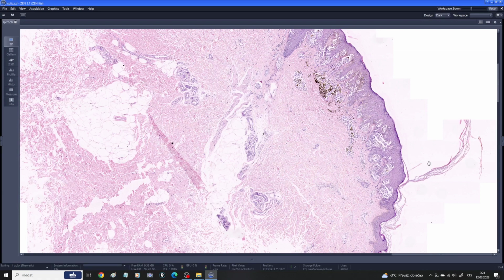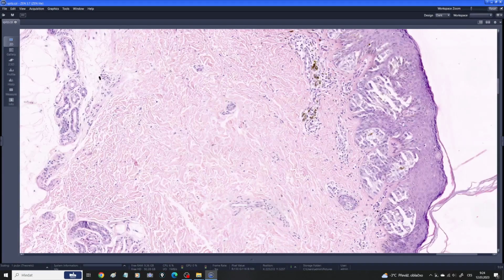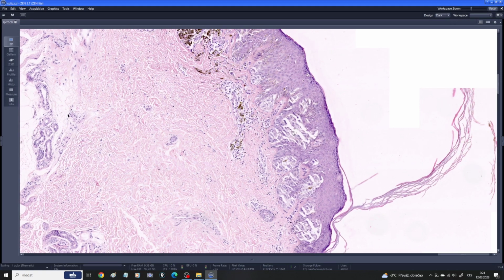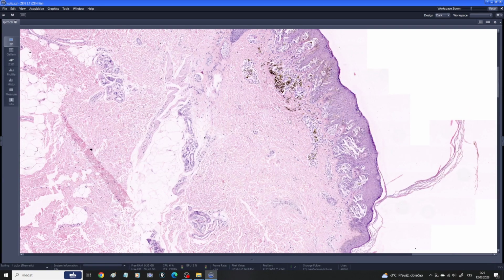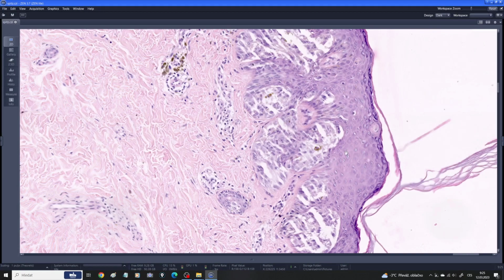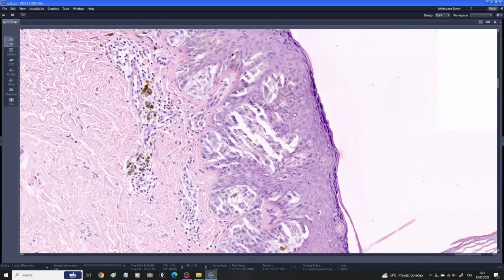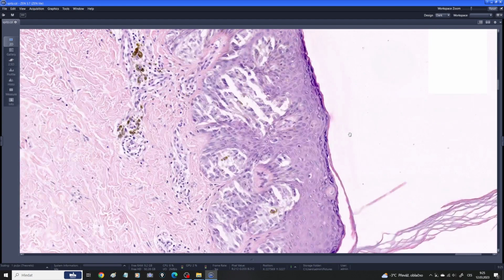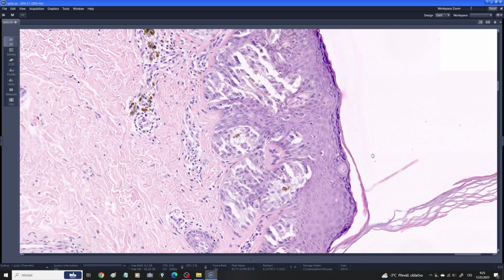And how does it look like histologically? Well, first of all, sorry for the quality of the slide. The slide is a little bit shattered, but I think we will be able to appreciate the basic features. And here you can see the lesion. Here you can see the nests. And I think even at the first glance, we can see that this lesion looks more worrisome compared to the previous ones. And it is quite worrisome on both the cytological and architectural level.